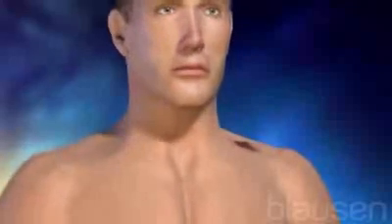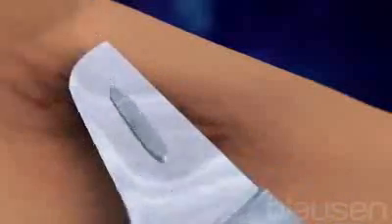Another type of skin biopsy is a shave biopsy. During this procedure, a very thin layer of skin is shaved with a scalpel and is removed for analysis. This is the least invasive type of biopsy and seldom requires sutures.